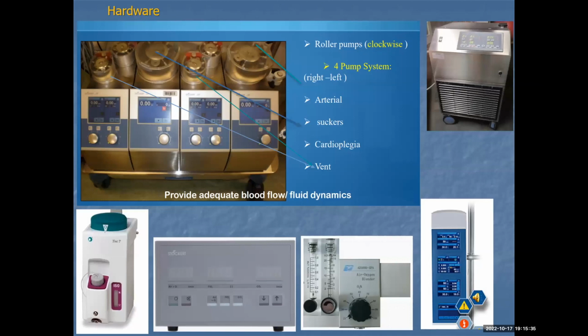So, like I said, when you come to set up a heart-lung machine, first we need to check the hardware. So you have the hardware and you have the disposables. This is the pump configuration we have at University Hospitals Leicester.